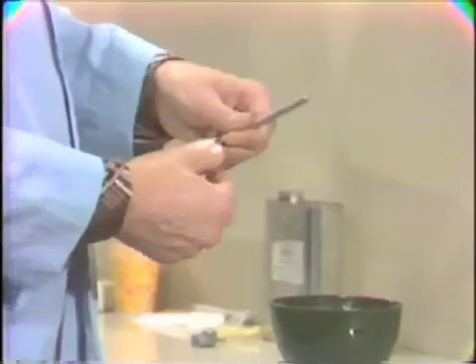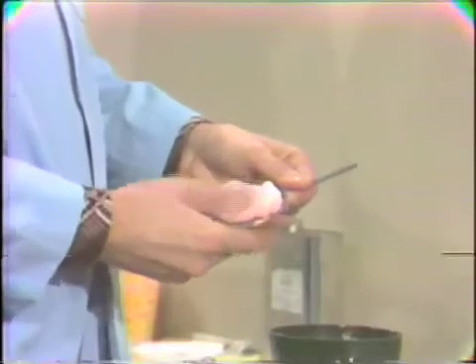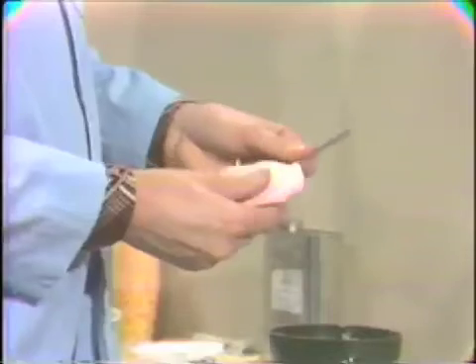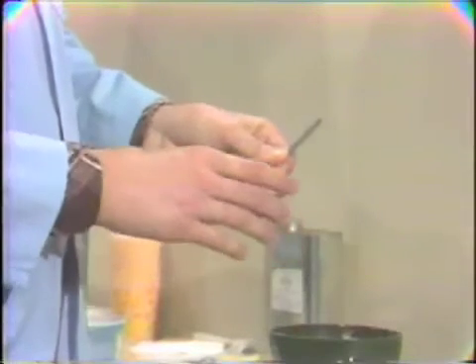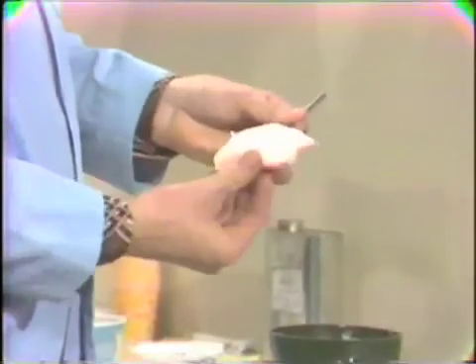Now we'll go ahead and load the lower portion. In loading this portion, it's important that we completely cover the entire area, because this is going to contain our stereographic recordings, and it's important that we have enough area to do so. So it's important that we cover the complete clutch former out to the peripheries, as you can see here.